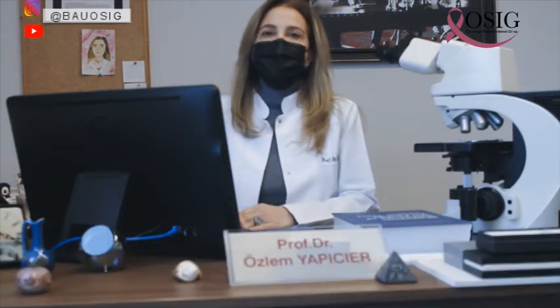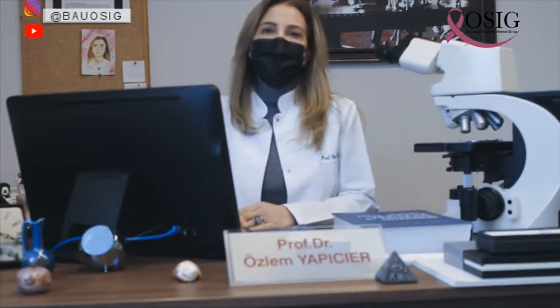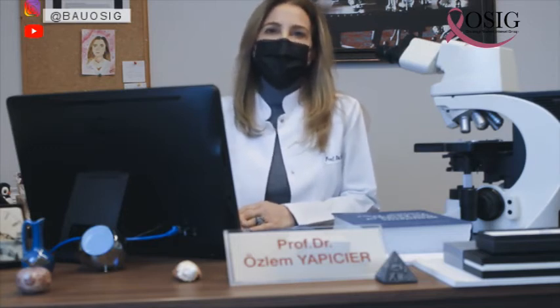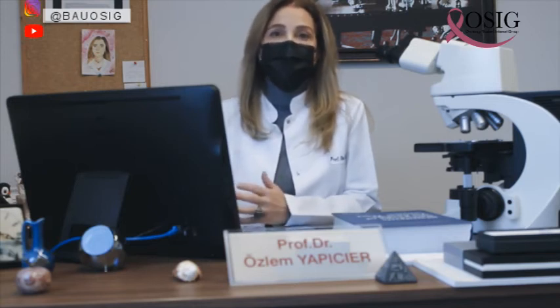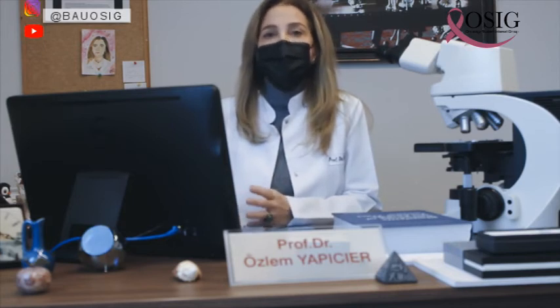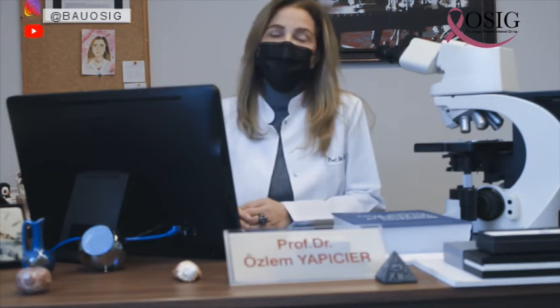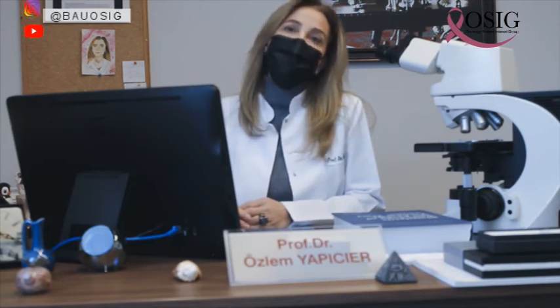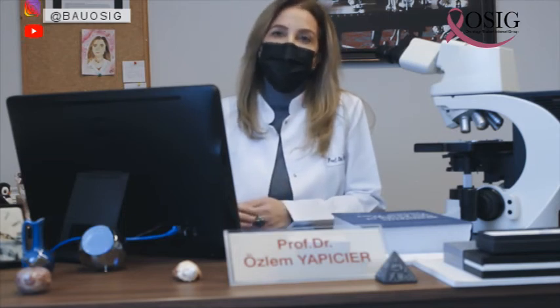We classify the results by using the Bethesda system. We classify them into several categories, starting with atypical cells of undetermined significance to cancer. So we have several categories, and these changes indicate HPV infection and also possible malignancy potential of the patient.